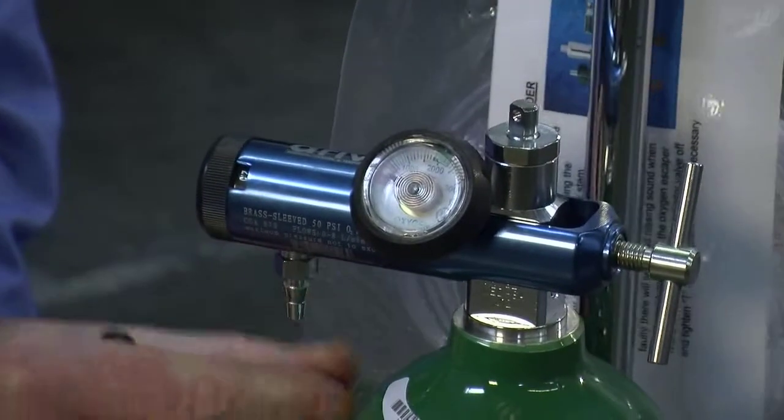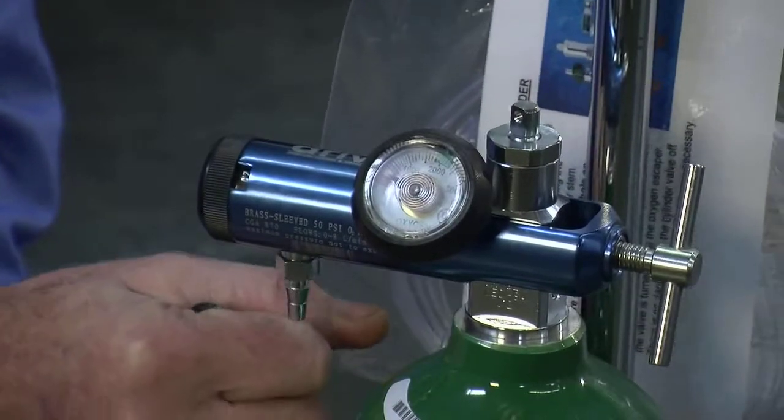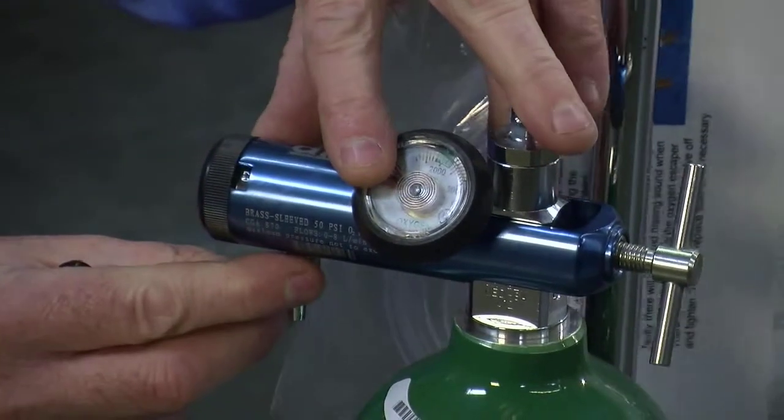From there, this is the outlet barb that the oxygen tubing is attached to.